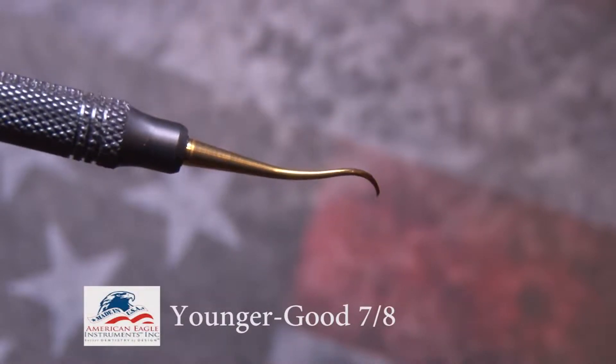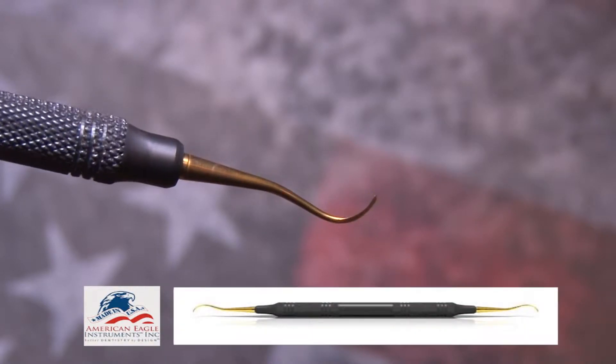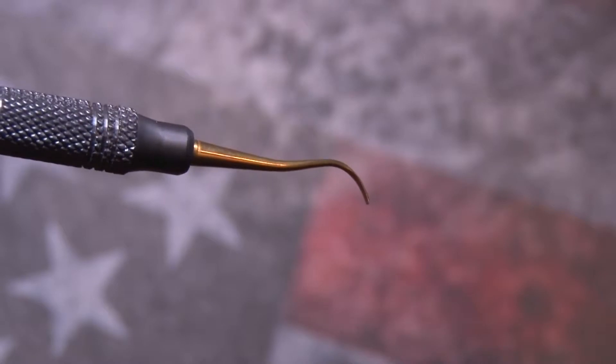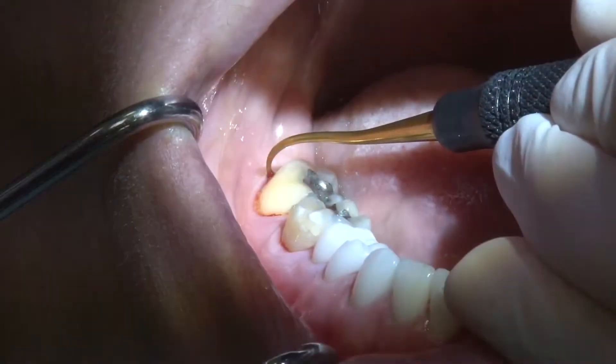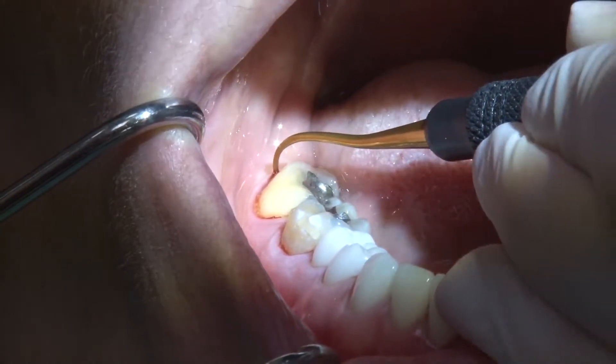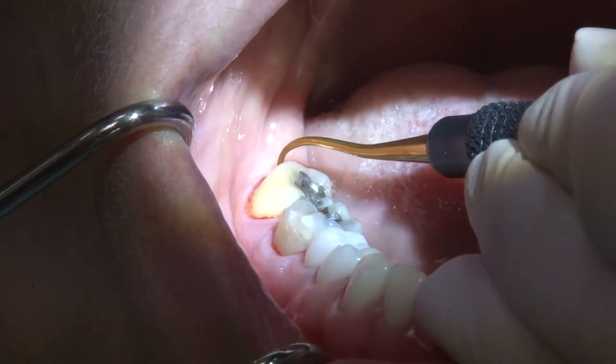The Younger-Good 7/8 curette in Sharpen Free XP technology has a small, gently curved blade designed to access terminal molars. To access the distal of the terminal molars effectively, insert just mesial buccal to the distal line angle with the toe directed towards the bottom of the sulcus.